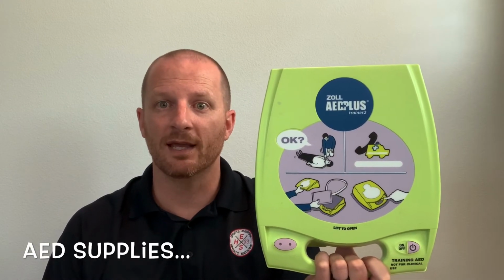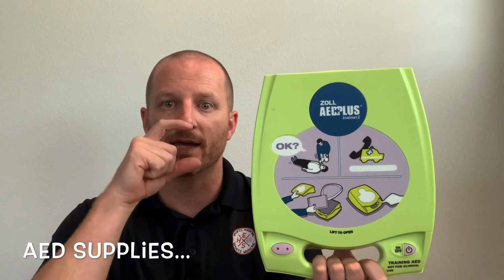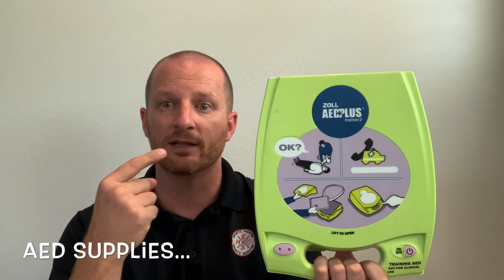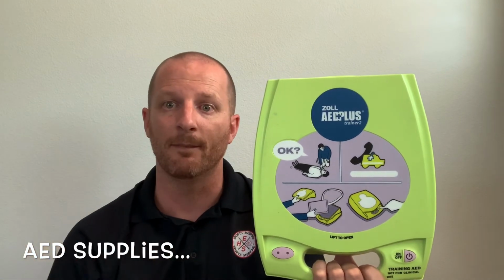The fourth thing in the bag is going to be a CPR shield. This is a little shield that we can actually put over the patient's mouth, and this is going to be for your protection. It has a one-way filter that we want to put directly over the mouth, and it has guards that go over the ear to keep the mask in place.